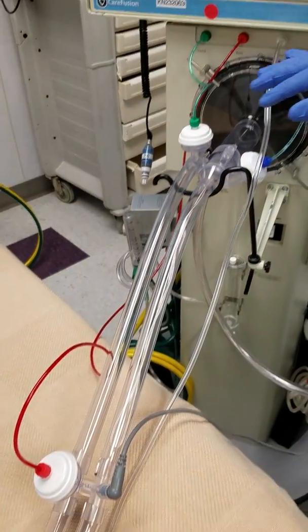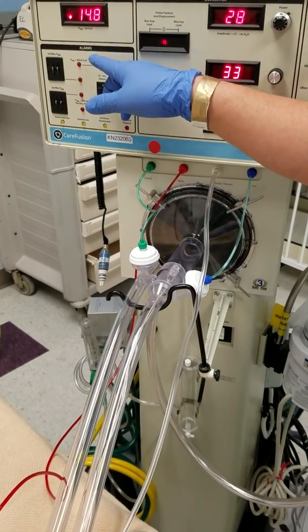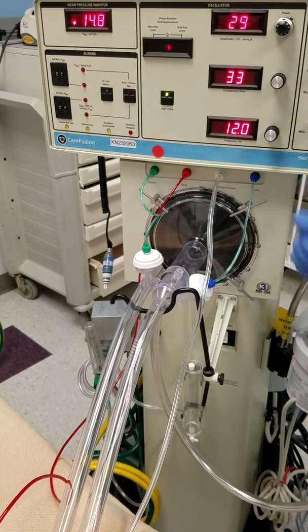First of all, our very basic setting for our premature baby here: a mean of 14, delta of 28, 33 percent with a hertz of 12, and our center piston.